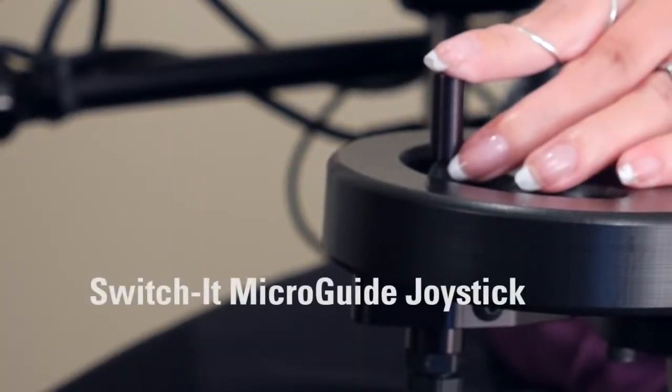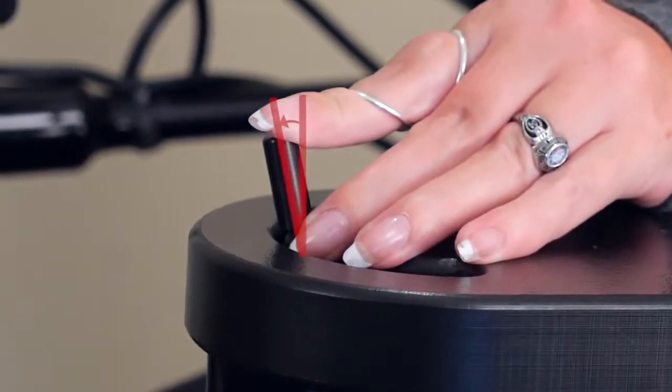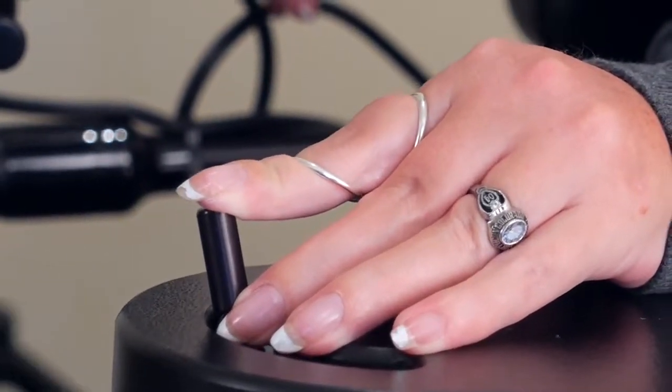The MicroGuide has the size and durability of the MicroPilot, but with the physical joystick throw or deflection for clients that prefer movement feedback for hand or chin applications.